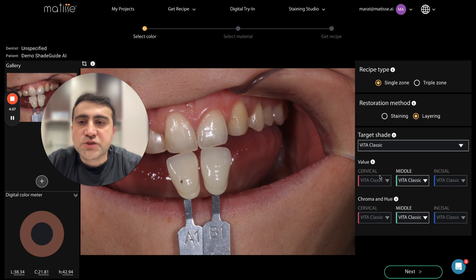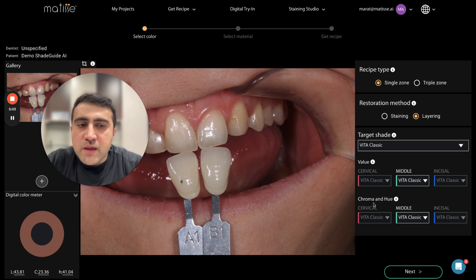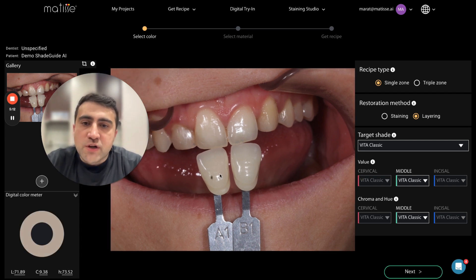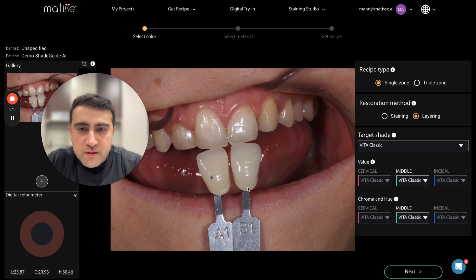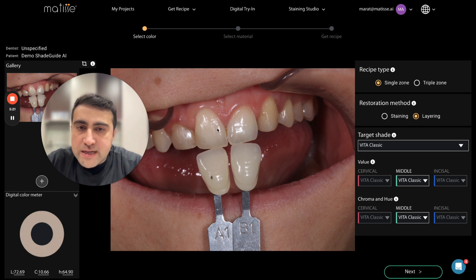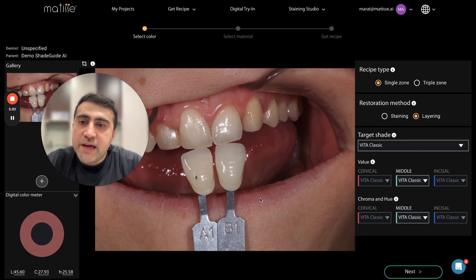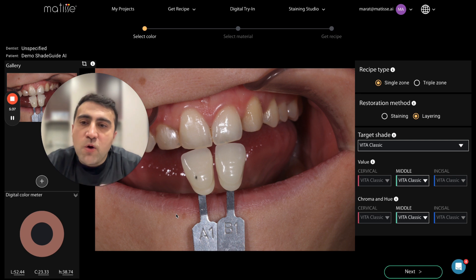We will try to find the color of the natural tooth based on the value and chroma of the shade tabs used. First we want to find the shade tab with the closest value. From these two shade tabs, which is the closest value? You can look at it visually. If you have experience and are confident about the value, you can just go here and select it.